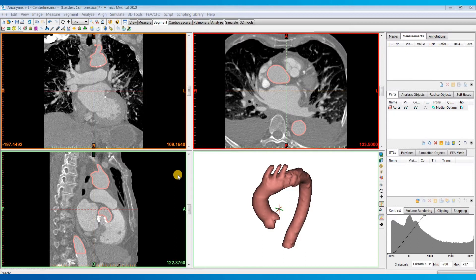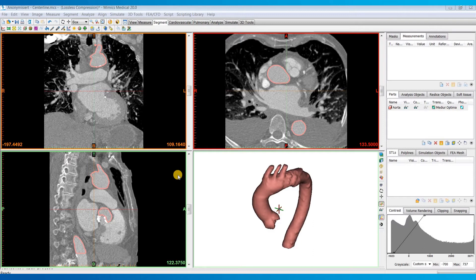This tool allows you to calculate the center points along a tubular structure, take measurements of the anatomy, and then export these measurements as a text file if you'd like. Typically, this tool is used for cardiovascular and pulmonary applications, but could really be used for any anatomy that has a tubular morphology.